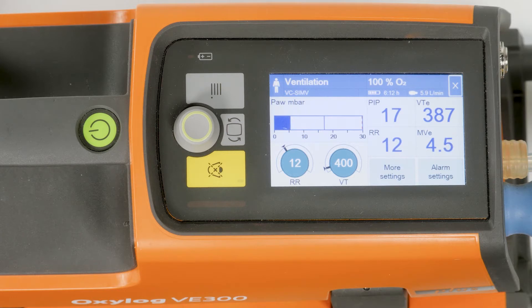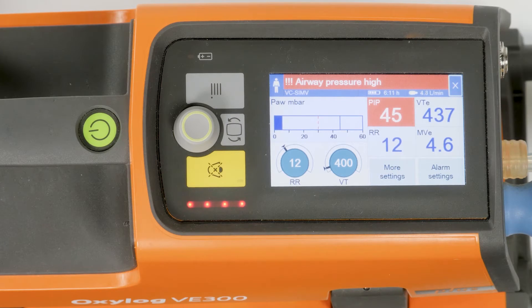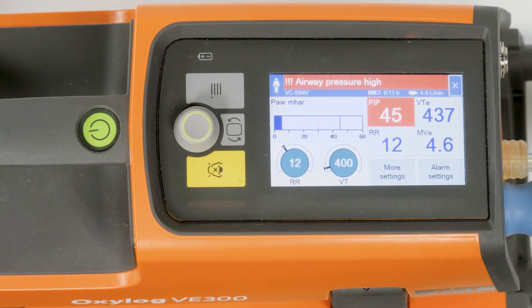A high priority alarm is highlighted by three prefixed exclamation marks. The alarm indicator flashes red. The acoustic alarm signal consists of five tones, repeated twice about every six seconds.